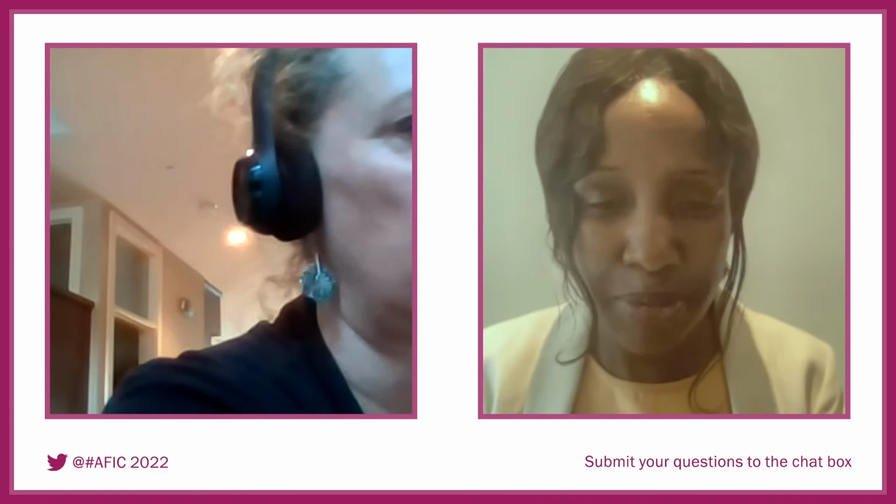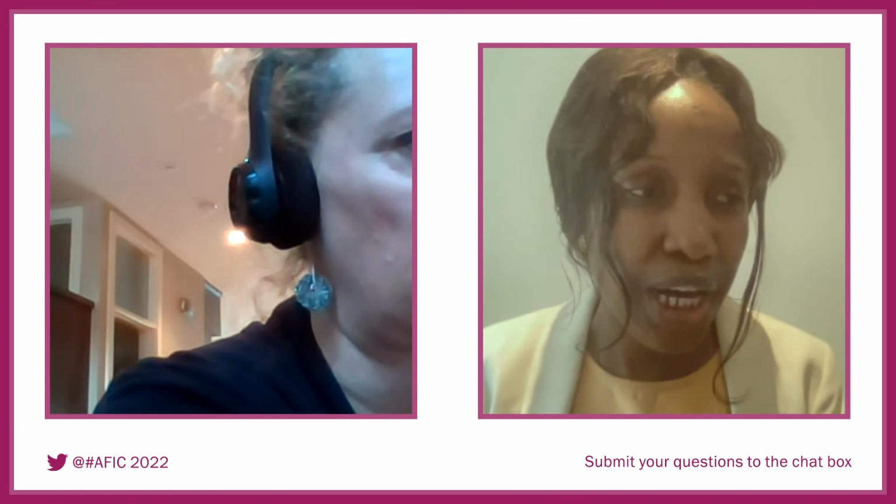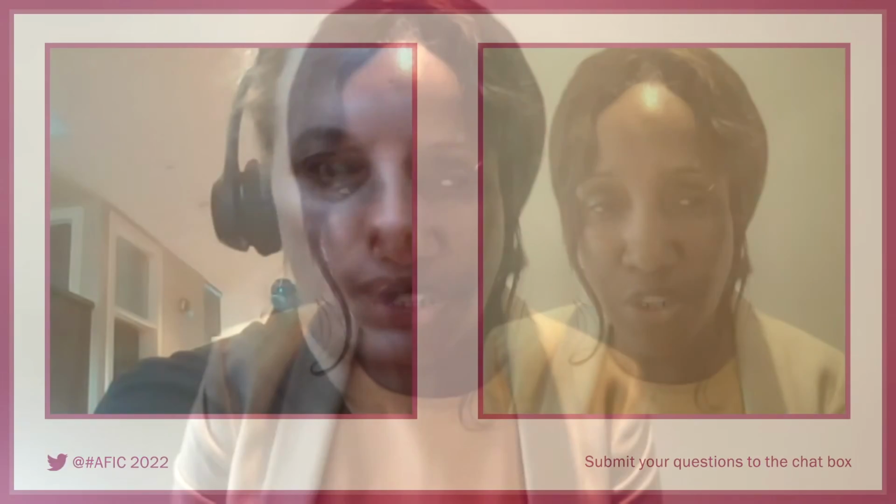Thank you very much. And I would add that when we're talking about doing the Dopplers, we are referring to centers that have already trained or are in collaboration with MFM to do these Dopplers, so that there's appropriate interpretation.